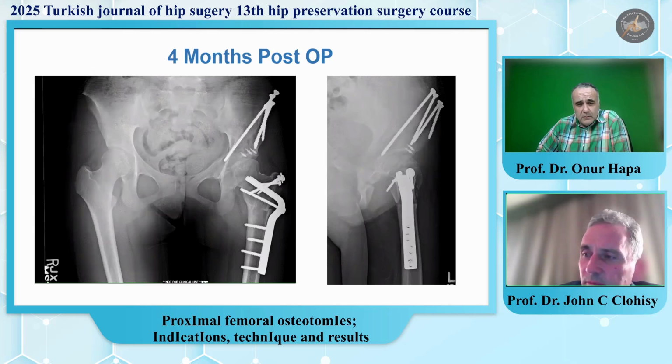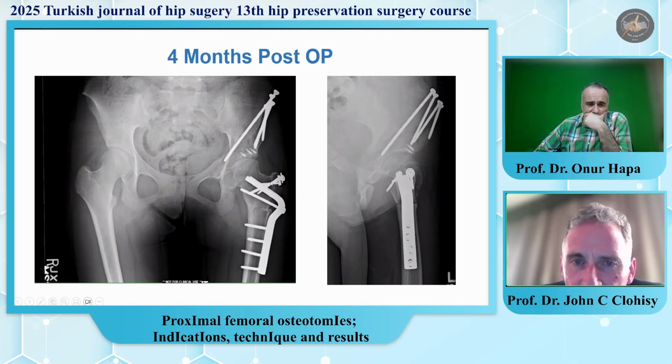So here she is 4 months after surgery. So we've started on the femoral side. We've done the head reshaping. We've done the recontouring or thinning of the neck. We then did the proximal femoral valgus osteotomy, and then refixed the greater trochanter. Prior to refixing the greater trochanter, we assessed the hip, thought it was unstable. Most of these hips are unstable, more posterior superior. They slide out posterior lateral in flexion. That's usually what provokes us to do the PAO.